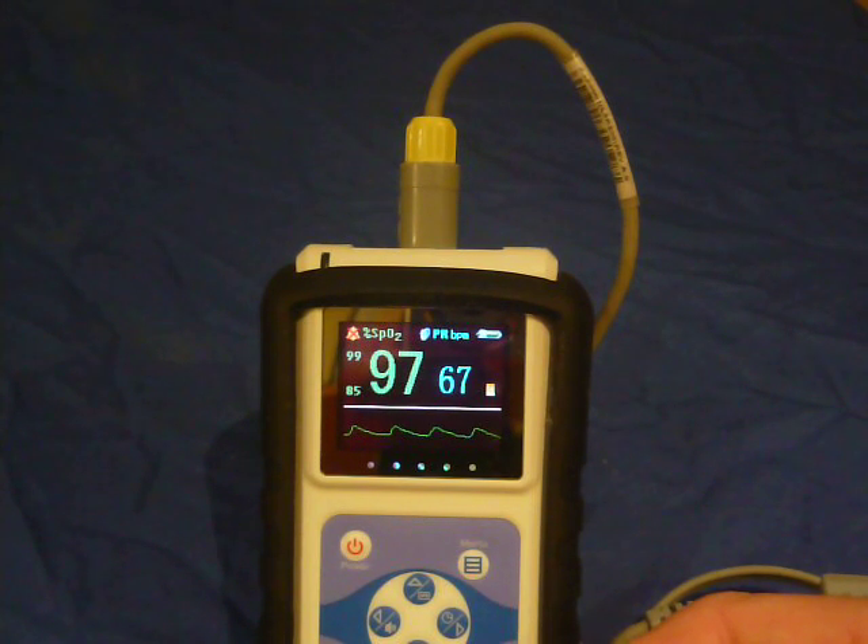Overall, the Vetsense P02 works well and is very reliable. But there are a few points to note.